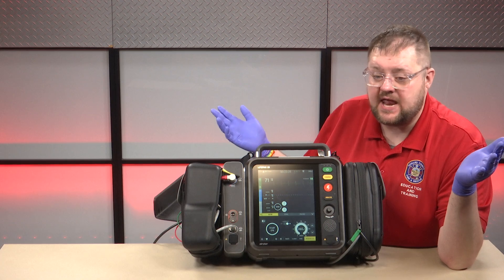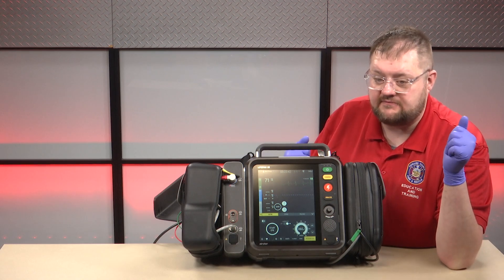And that is the manual defibrillation method for the LifePak 35.